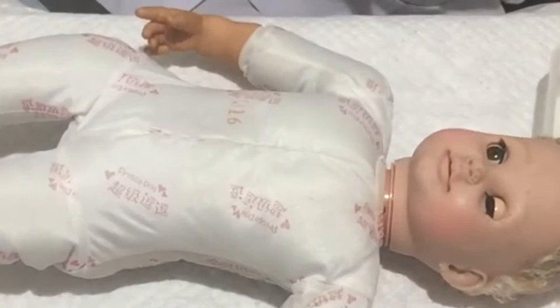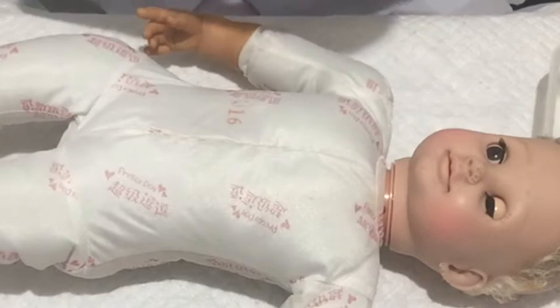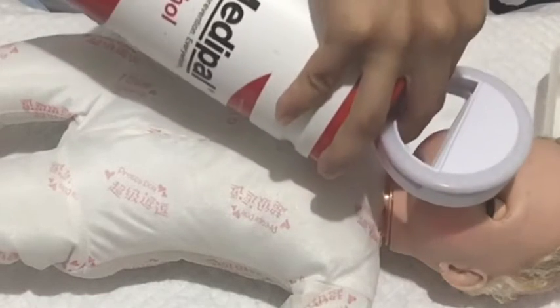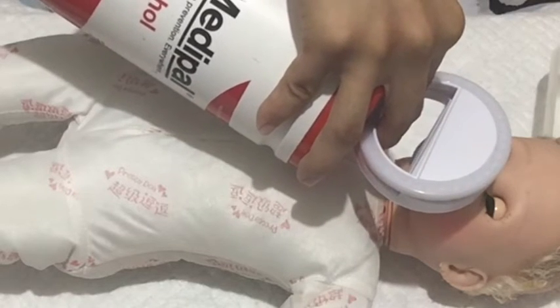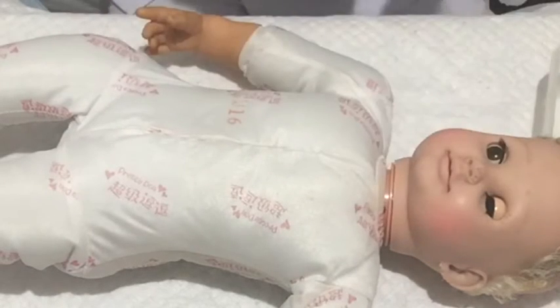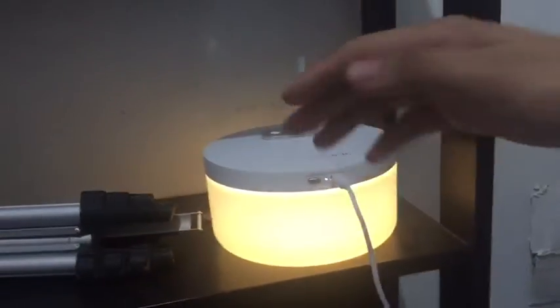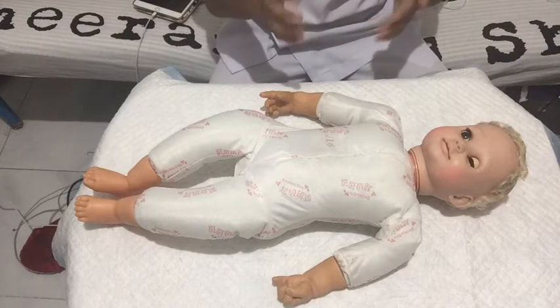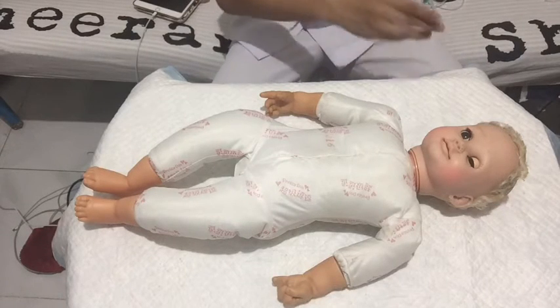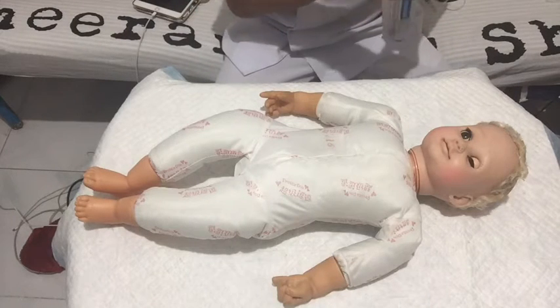Now, if the baby is having a hard time breathing or lacks oxygen, what we should do is oxygenate the baby to avoid risks of hypoxia. Make sure that the suction setup works. Before starting, we have to estimate the depth of suctioning.